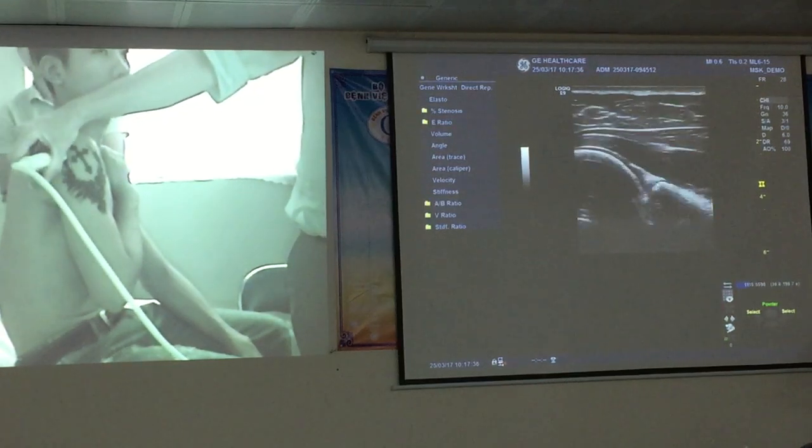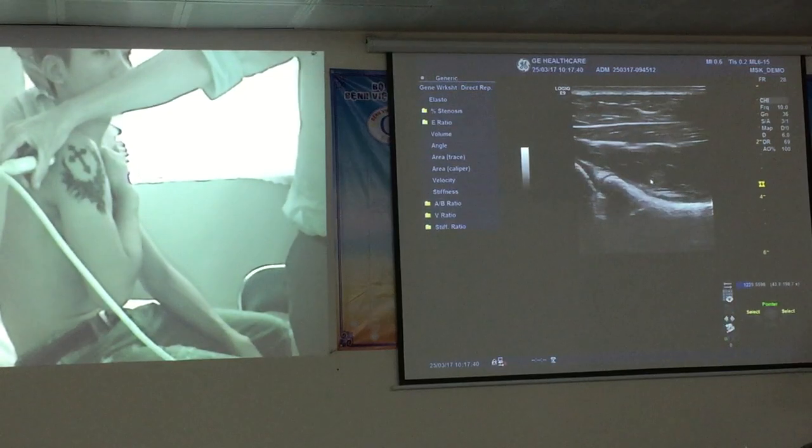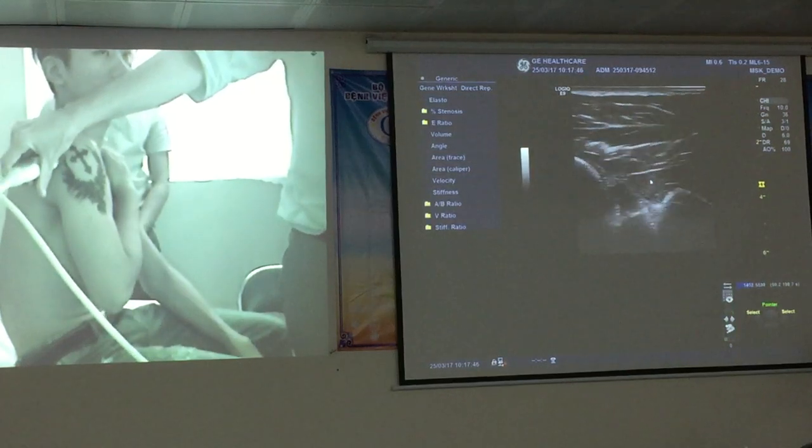To get to that plane, from the posterior joint, we slide a little bit more posteriorly and angle up towards the patient's head. To recap, we move a bit posteriorly, lower down, and angle the probe upward.